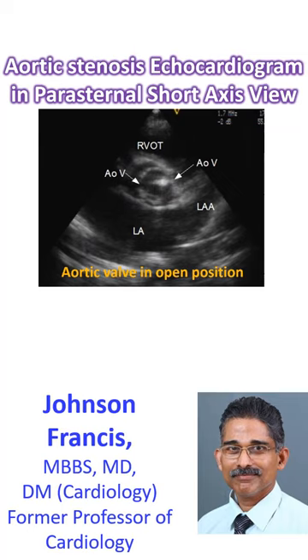In this image, the aortic valve is seen in open position with possibly a single commissure which is thickened, suggestive of a unicuspid aortic valve.